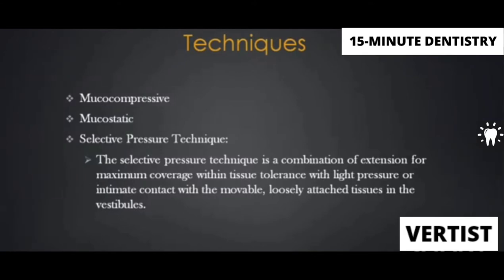In mucocompressive, while making the impression, we are going to compress the mucosa completely. In mucostatic, we are going to ensure that all the mucosa is completely relaxed. None of the mucosa is compressed. Both these techniques have their own advantages and disadvantages, which you can read in the theory. What we usually follow is the selective pressure technique.